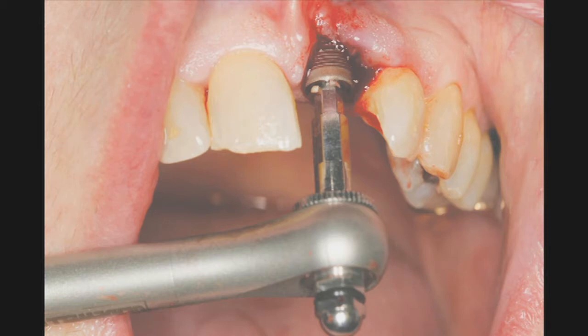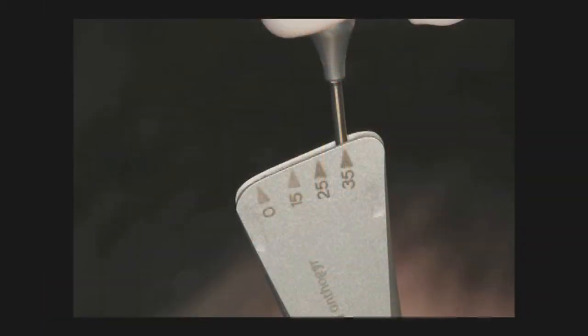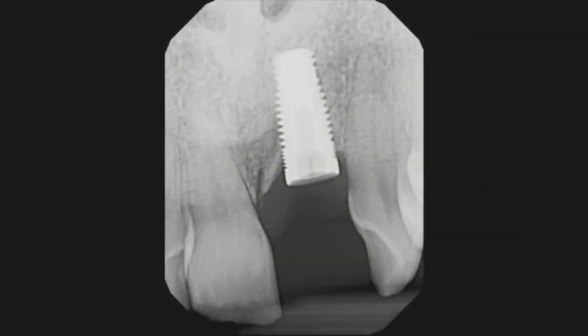So the implant is threaded in by hand, and then a ratchet is used with an internal hex torque driver, and the implant is positioned. And you can see that we were using the torque wrench. We were able to torque it down to 35 Newton centimeters, which is wonderful. Now, as I demonstrated before, if we torqued to 35 Newton centimeters, theoretically, we could load that implant immediately. We took a digital radiograph of the implant in position, and you can see that the neck of the implant approximates the cemental enamel junction of the adjacent root. So we should get good emergence profile in our final restoration.